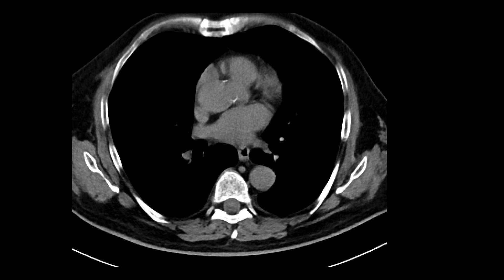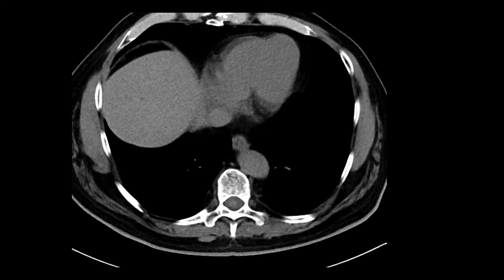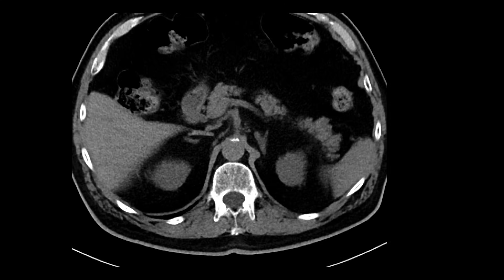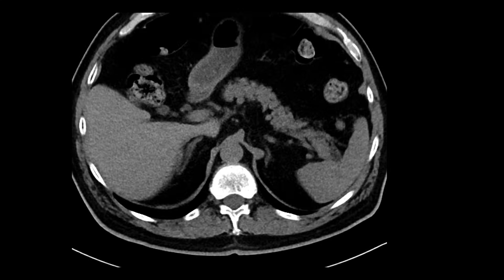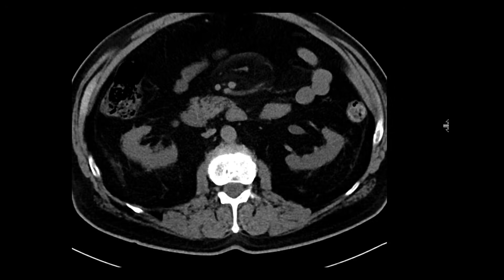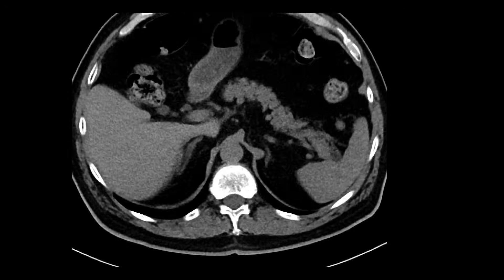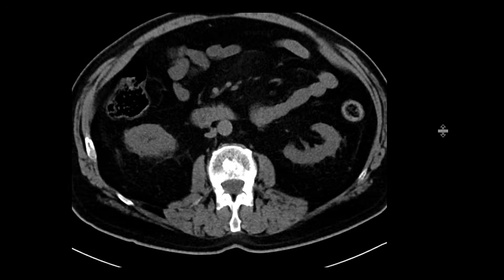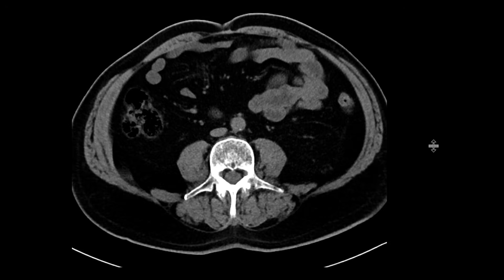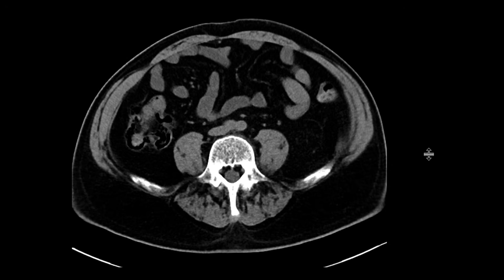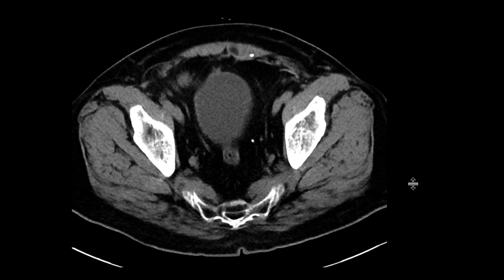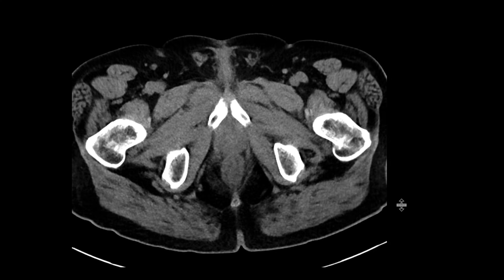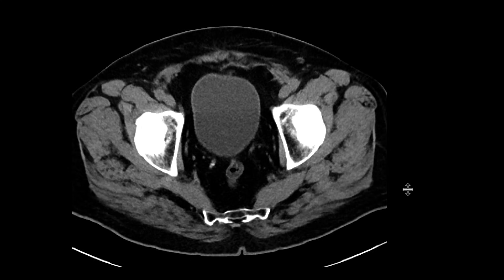This is a patient who comes in with some flank pain and got a CT scan without intravenous contrast. Most of the organs look pretty okay. If you scroll downwards, not too much to comment on. No oral contrast was given for this study, so it's always a little bit more challenging to evaluate loops of bowel without oral contrast.